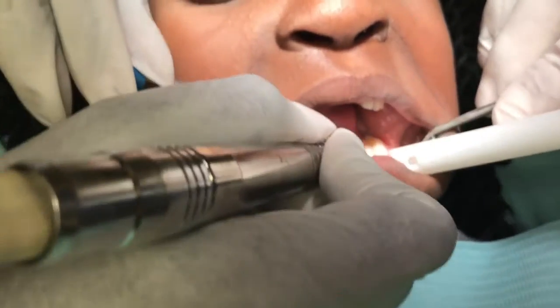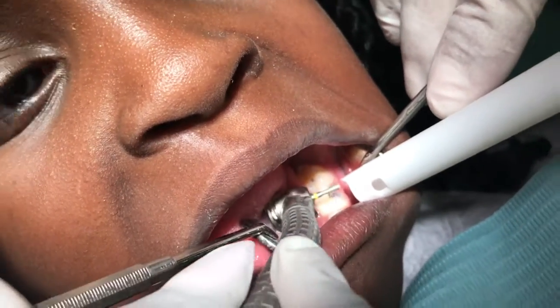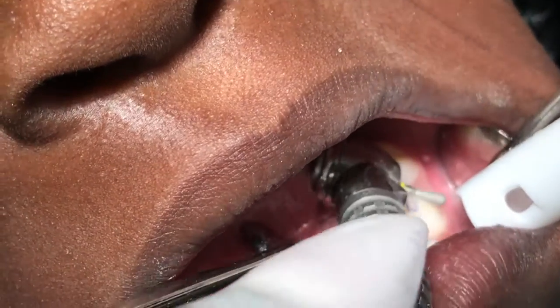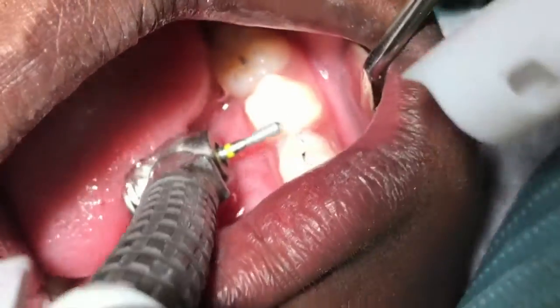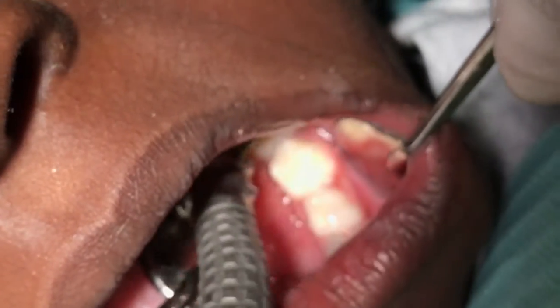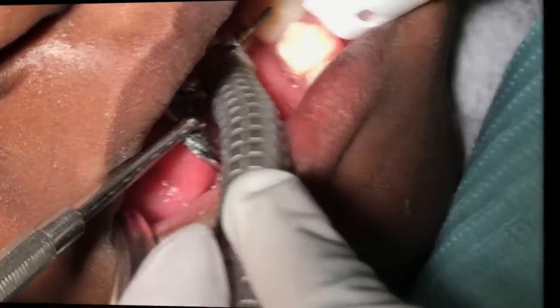And when we're talking about painless, this is my own daughter. Believe me, she's pretty dramatic, if she was in pain, I would know. So you can see me smoothing out the filling. I just continue to do that until there are no more blue marks that are not supposed to be there. And this is true of any filling, child or adult: you go home and you brush your teeth, and any residue that's on the tooth typically goes away.